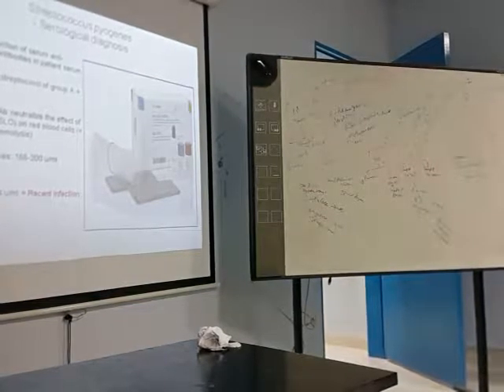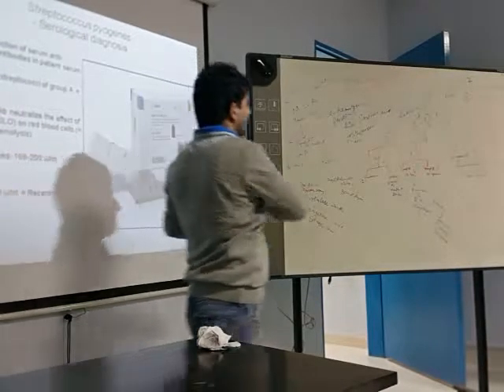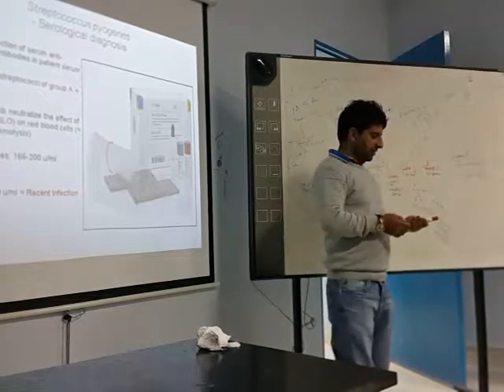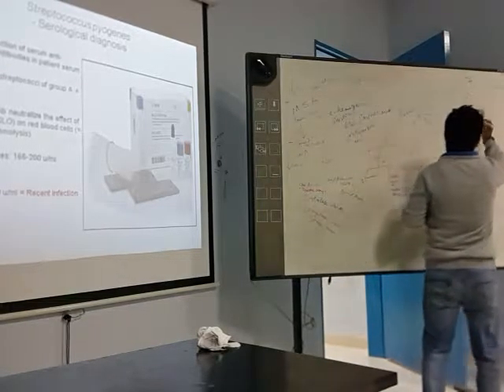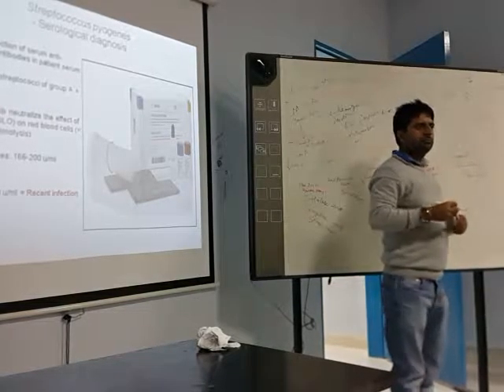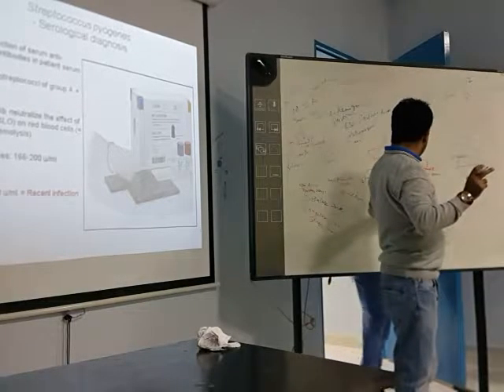Now this is one more test, one test for Streptococcus pyogenes. Another test is ASLO. You know this test? Anti-streptolysin O, an antibody produced against the streptolysin O.